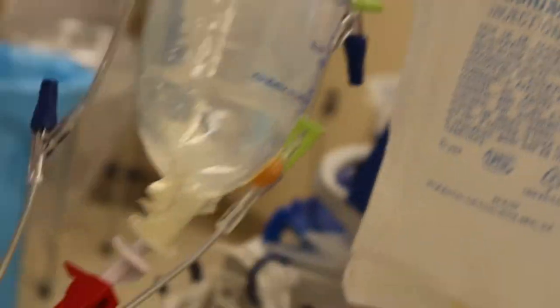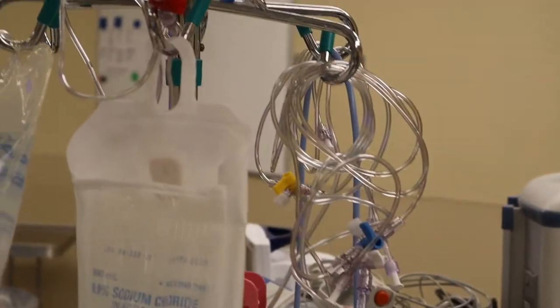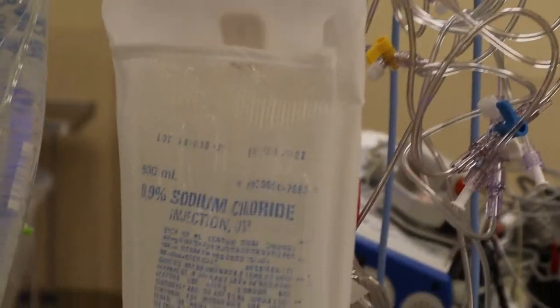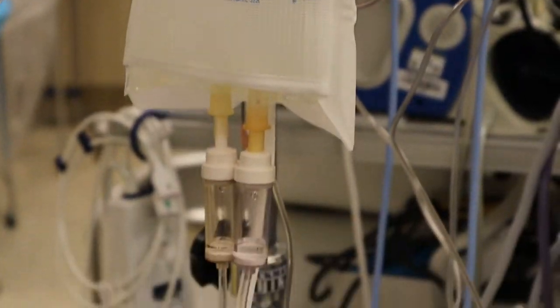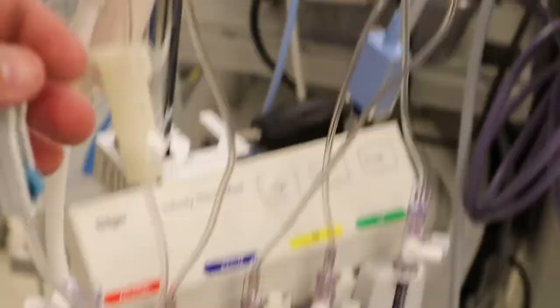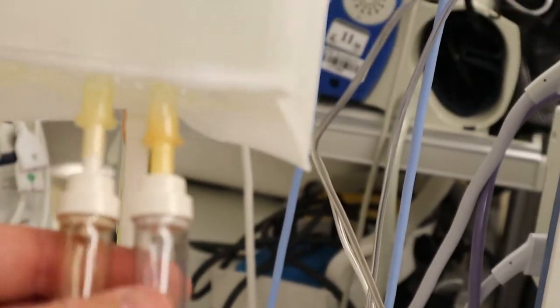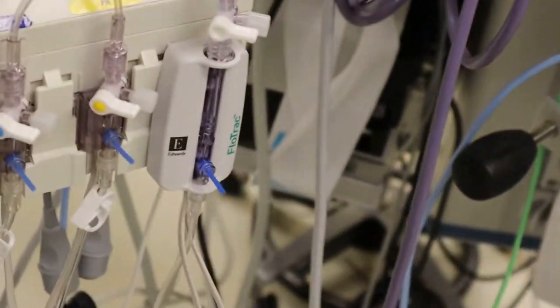We've got our fluid line over here still — I'm going to pull this out of the way. That's going into our Ranger with our two extensions on it and our blood tubing. The transducer setup is like this: here's your 500cc bag and your pressure bag, and we've got our two ports. One is for the triple transducer, which are the first three ports over here, and the other port is for our flow track, our Edwards, and it goes into the far right port on our hemopod.